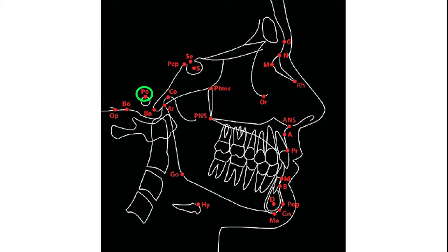The use of ear rods in the cephalostat often makes anatomical porion difficult to locate, in which case the superior margin of the glenoid fossa on the temporomandibular joint that lies at the same level may be substituted for constructing the Frankfurt horizontal plane. The term machine porion refers to the most superior point of the image of the ear rod, which some authorities used as an alternative.